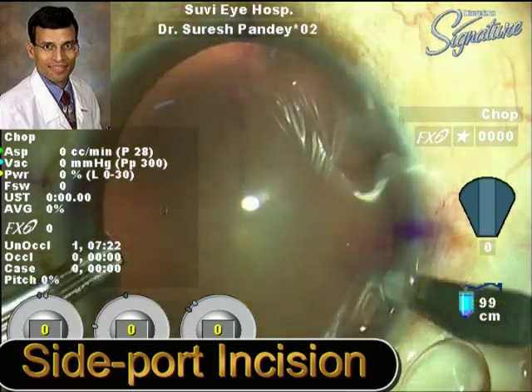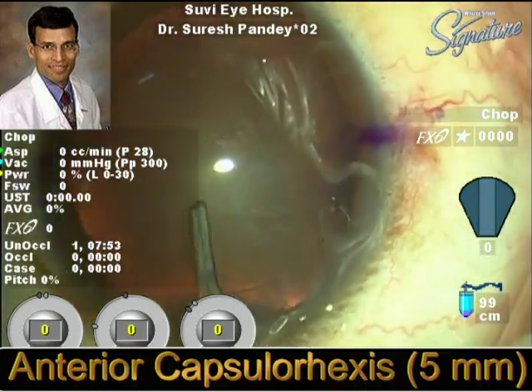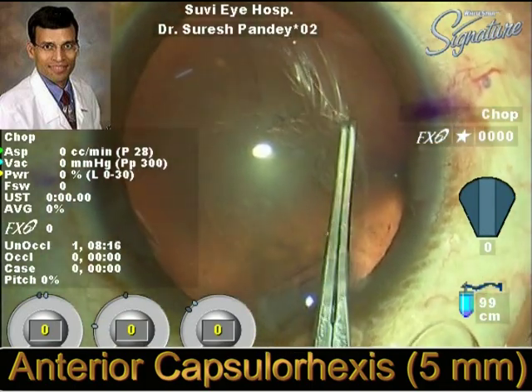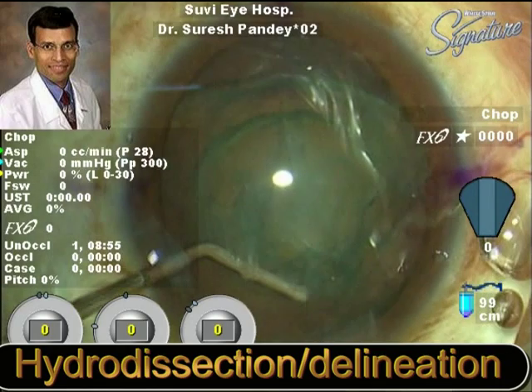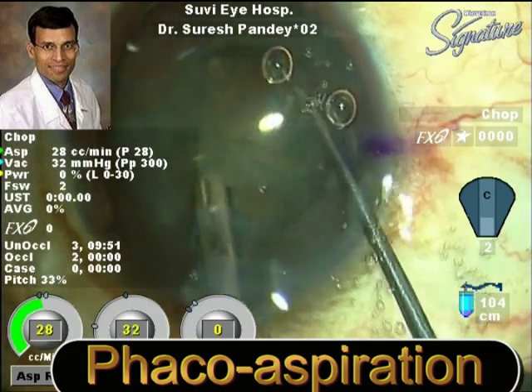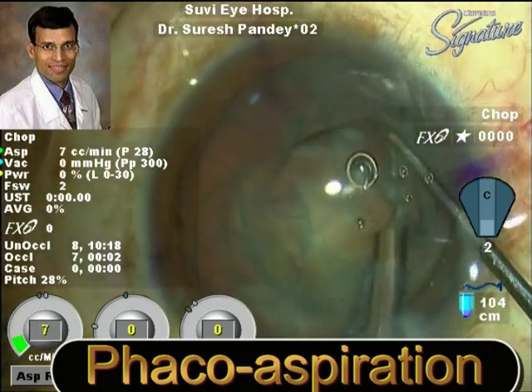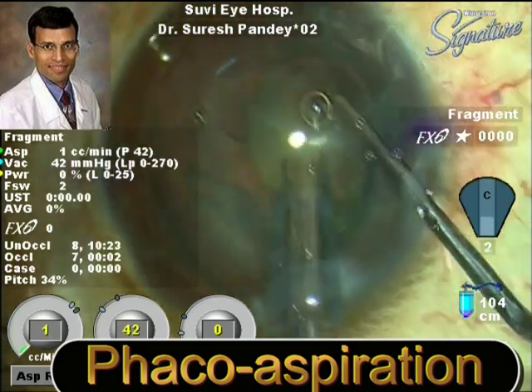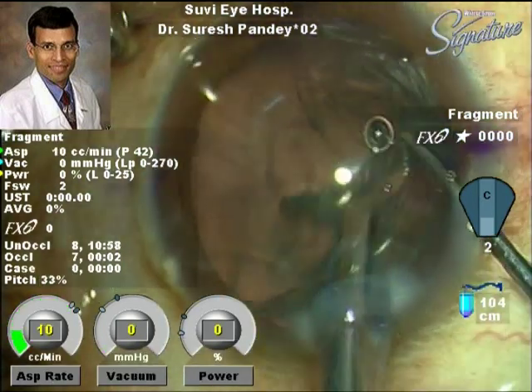The side port incision is being made and the main incision is made along the steep axis. Standard phacoemulsification surgery steps are performed: the continuous curvilinear capsulorhexis, followed by hydrodelineation and hydrodissection. This was a very soft cataract and it was removed using the AMO Signature phaco machine with the Ellips FX handpiece. Because of the cataract being very soft and the excellent fluidics, the cataract is being removed with an effective phaco time of zero.